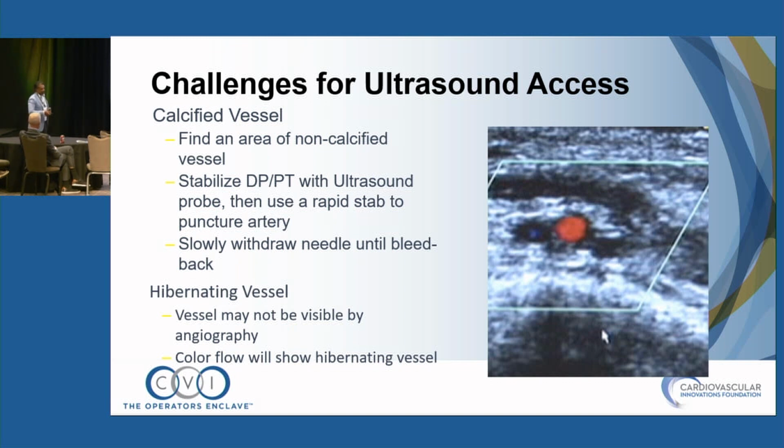So calcification. A couple of tricks for the calcium. What's going to happen is it's going to start rolling around on you. So a couple of tricks that I have is you really puncture instead of slowly trying to get access. You get right on top of it and then just pop it like a spear. So sometimes then you can get in. The other thing is tether it and really compress. If you know you're right on top of the artery, compress the artery and hold it with your ultrasound probe, then pop through it and then release your ultrasound probe and then pull your needle back.